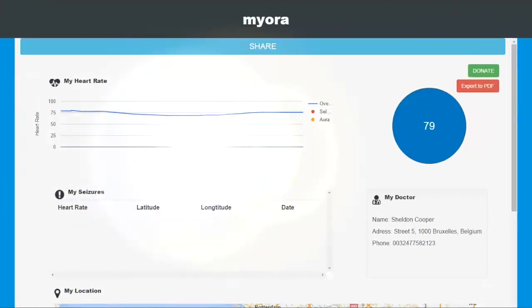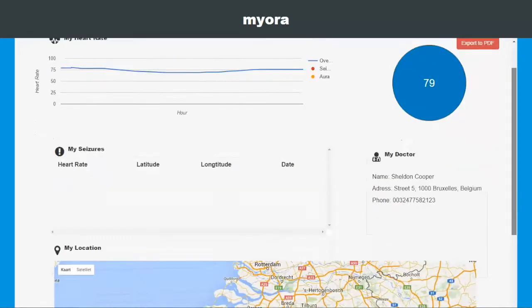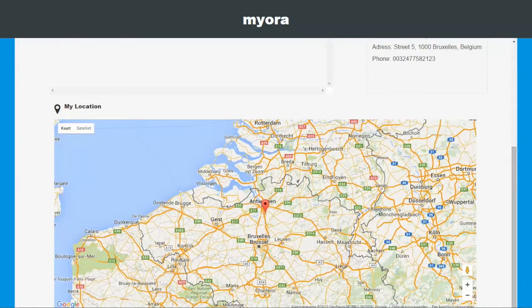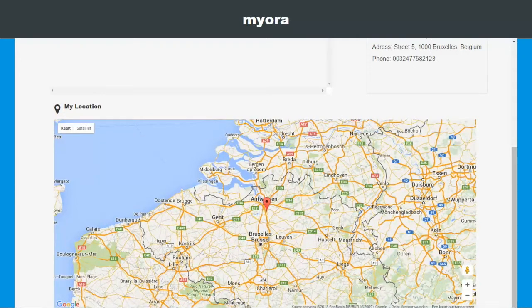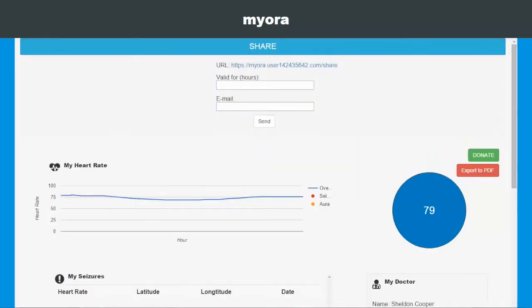The next application of our epilepsy monitor system is the family application. The family app is an HTML5 application where the patient can view all the data from the mobile application. The most important feature of this application is to share his information with his family.